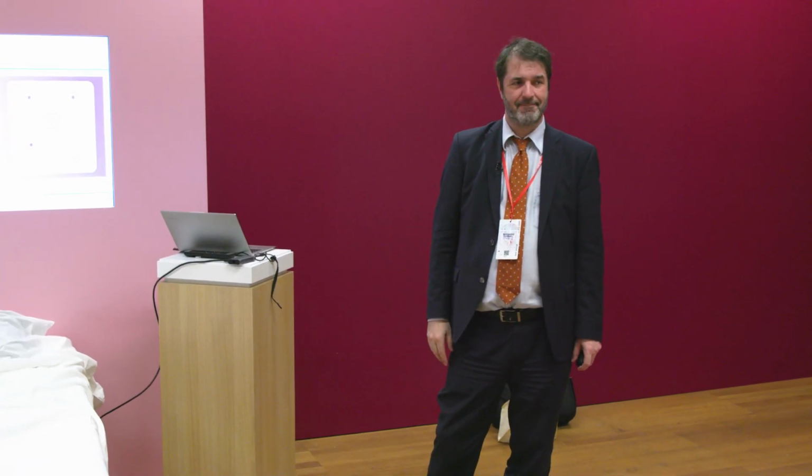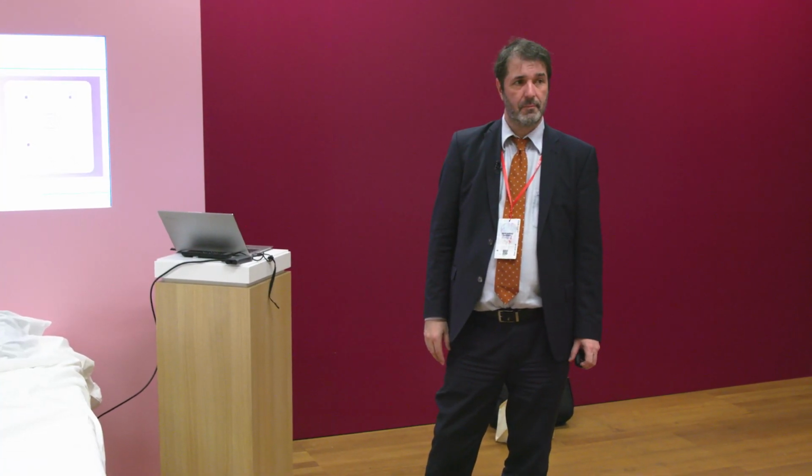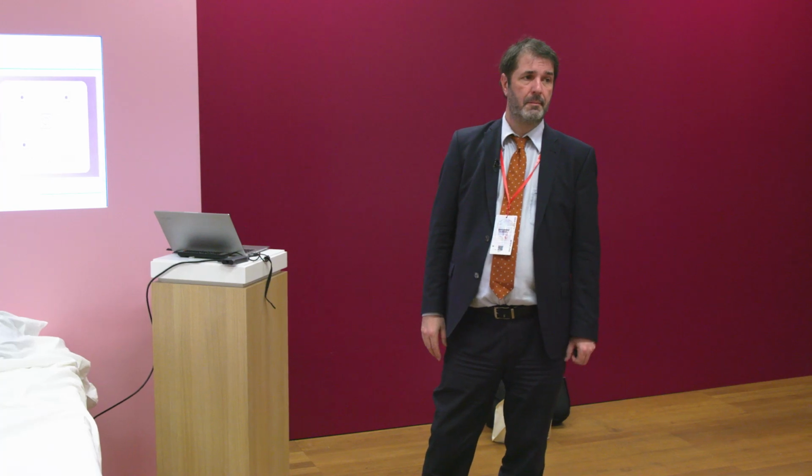So with fusion, you can take the benefits of each modality. You can take the advantage, for example, of CT, MR for, let me say, tissue mapping, and then using ultrasound for live ultrasound imaging. This is also one of the key benefits, having something static and something live just to overlay contrast information or color information. I think this is a very fantastic opportunity.